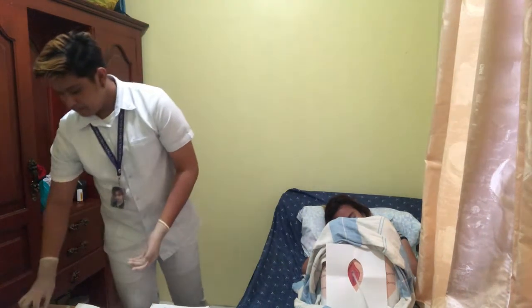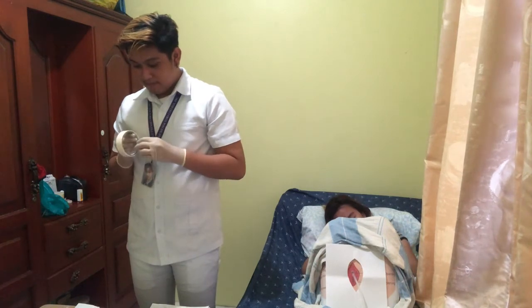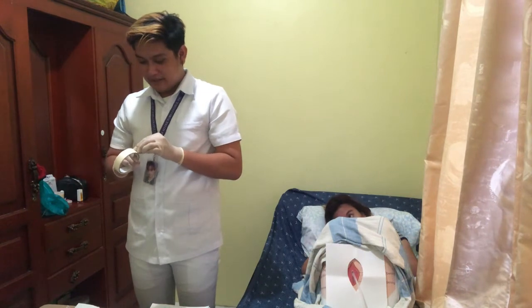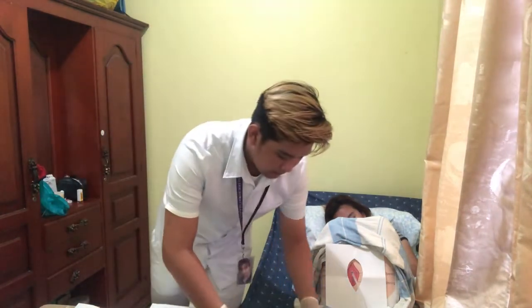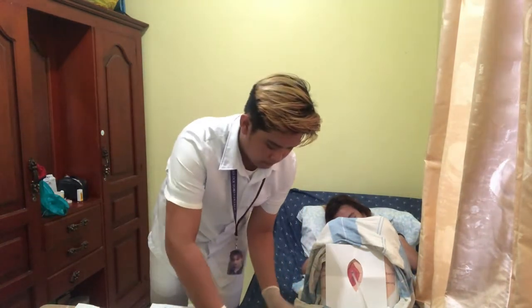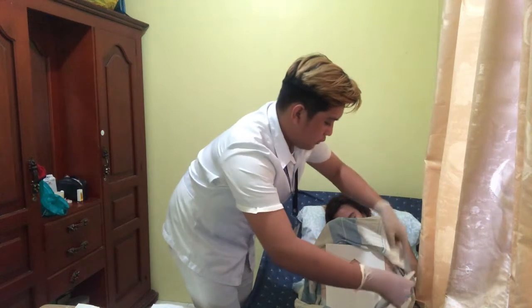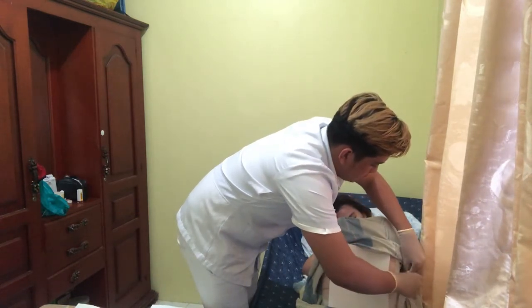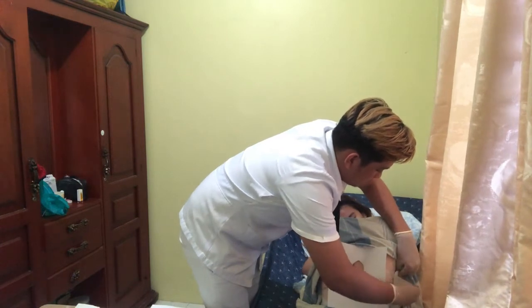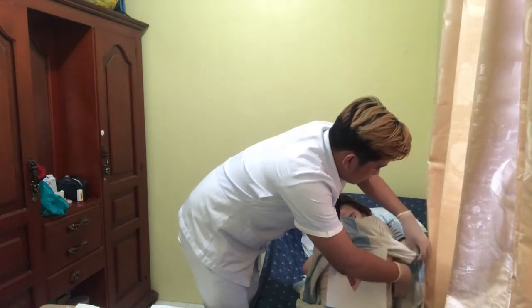We should also allow some slack in the tubing to accommodate the patient's movement. Okay, we'll secure this to her thigh.